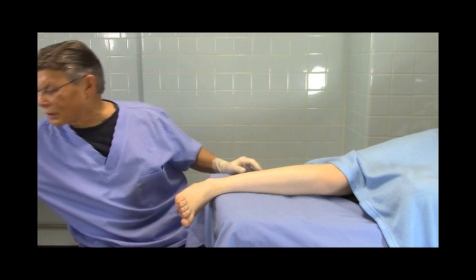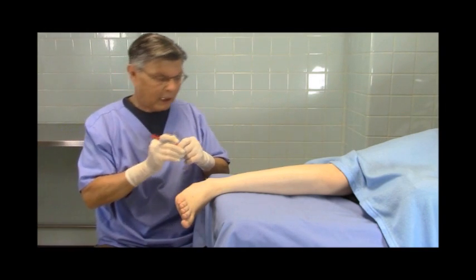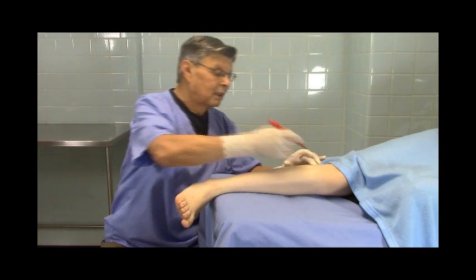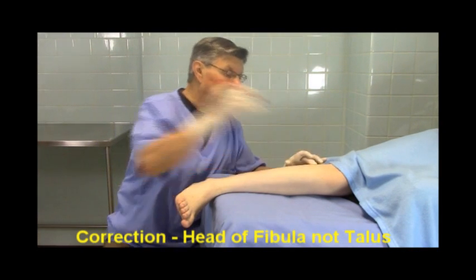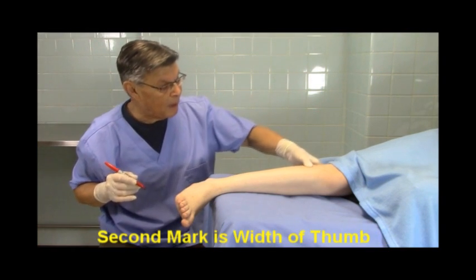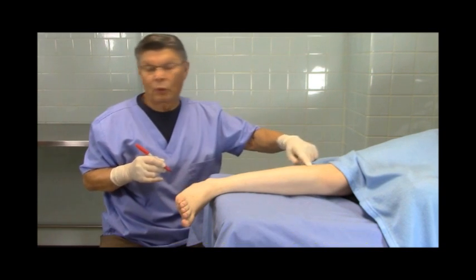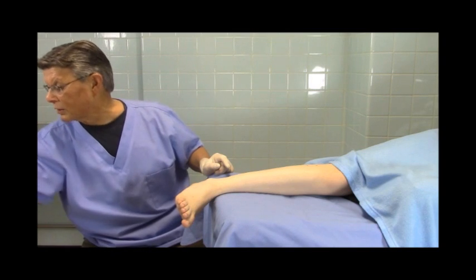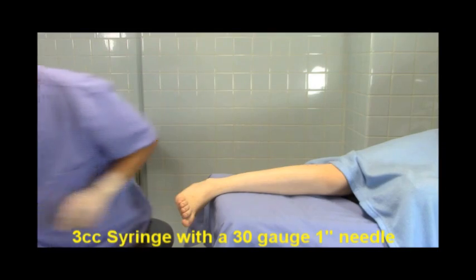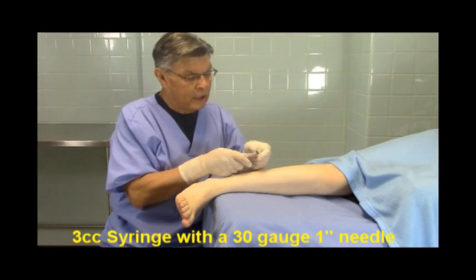What we do to find it — and this is so easy — is that we mark our area. We look for anatomical landmarks. Here's the head of the fibula, and I make a tiny little mark like that. Then I take my thumb width and make another little mark — a little line — and that's where I'm going to inject. The materials are very simple: we utilize a 3cc syringe with a 30-gauge, 1-inch needle.